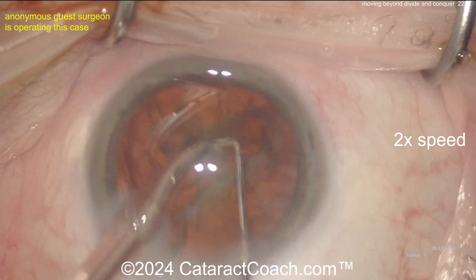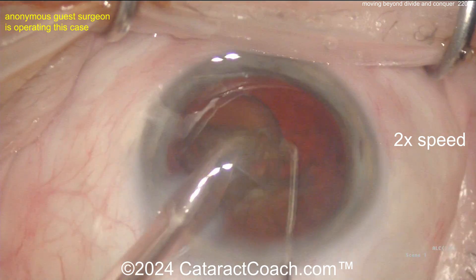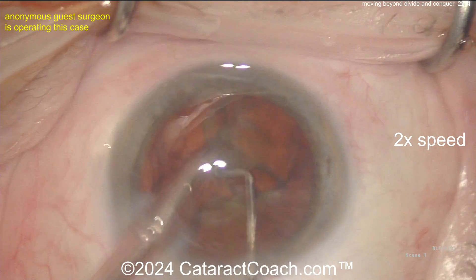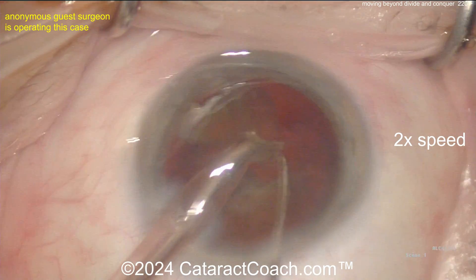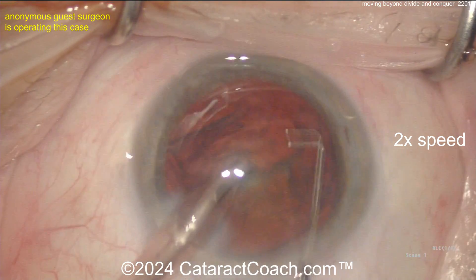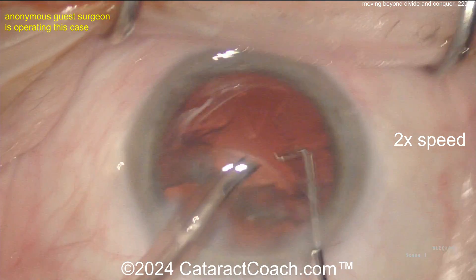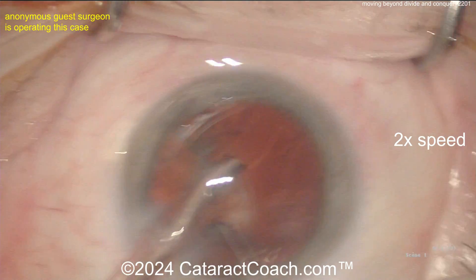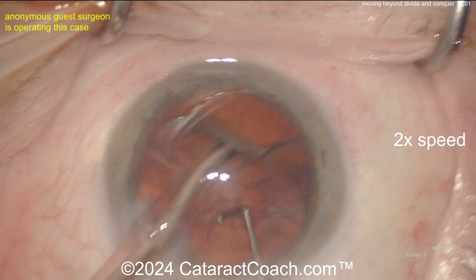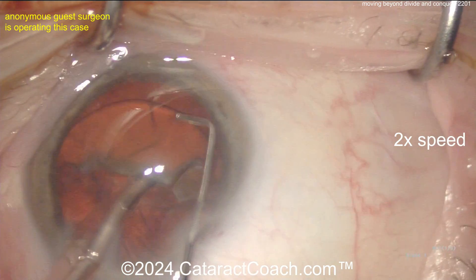Let's get this piece out of the way. Now with the remaining hemi-nucleus, it's important that you be able to accomplish at least a single chop — you've got to learn to do this. Good job getting that piece down. Get that rotated — I like that, good rotating with the second hand. There's the big hemi-nuclear piece now in the middle; vacuum, bring it towards you, but your chopper hit the piece — go around the equator.